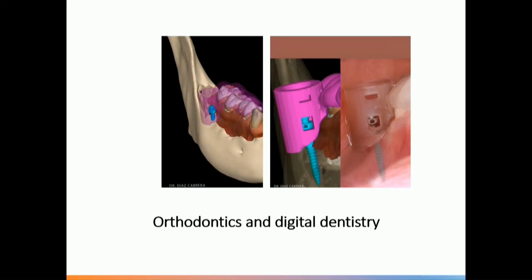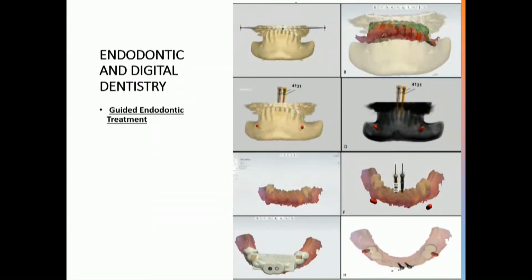He's a very nice doctor in, I think, Colombia, if I'm not mistaken, where he uses digital workflows to fabricate guides to place his mini screws to provide more anchorage for his orthodontic treatments. And I know that Dr. Ahmed Shimiri has done this case. This is not Dr. Ahmed's, but inshallah, next presentation, I will take your documents.